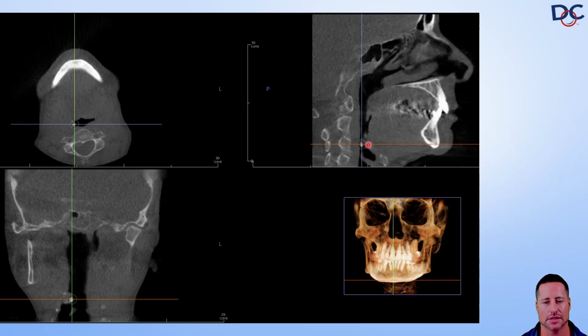Said, hey, look, you've got some things here. I just want to, in these areas, have them looked at. I'd like to send your image to an oral maxillofacial radiologist. The TC lets them know what the additional fee would be for that. It's not significant. I think our fee was like $70 or $80, and we charged the patient a little bit more than that just to cover our time to send it and read the report. It wasn't something where we make this a big profit, but we do cover our costs from the patient on that. And they're obviously typically fine with that.